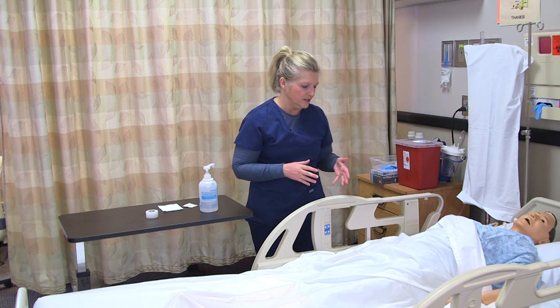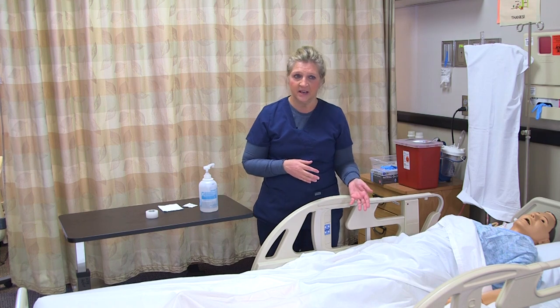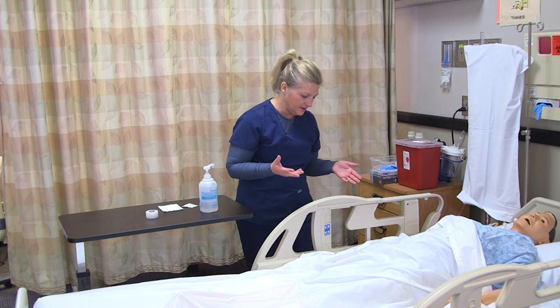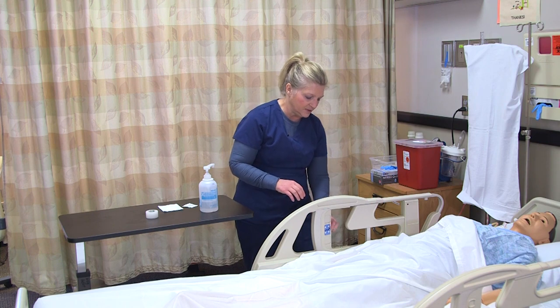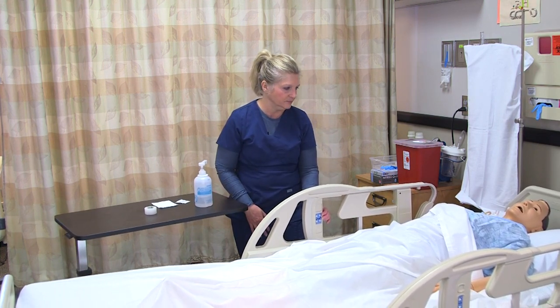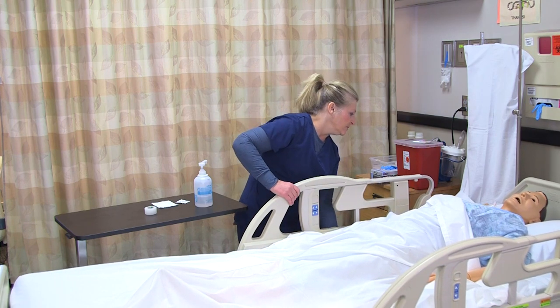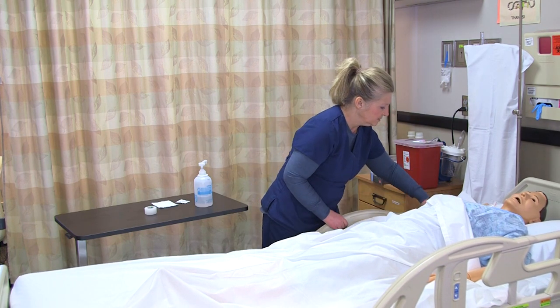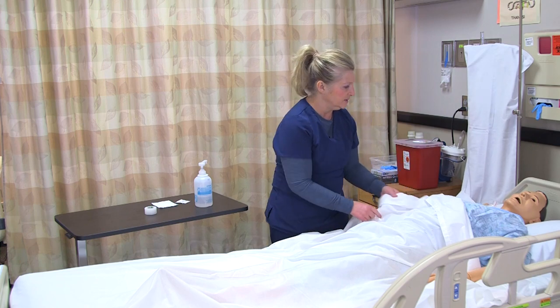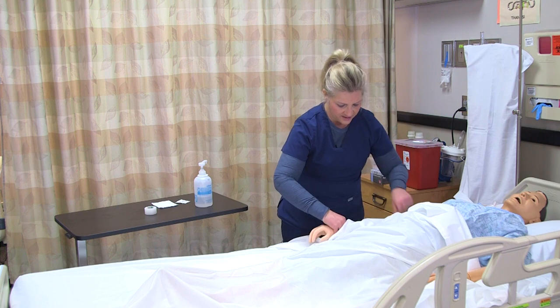I tell the patient that the provider has indicated that I may remove the IV because they're going home, and make sure that they understand what I'm doing. I'm going to raise the bed to an appropriate working level height and go ahead and look at the IV site.